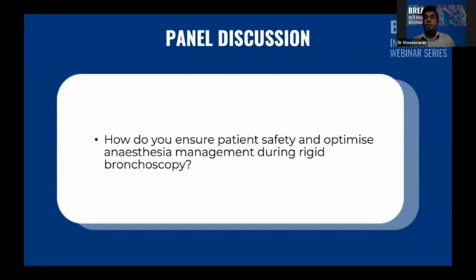Another thing is, especially when it comes to foreign bodies, and more so for a pediatric population, it is always advisable to have an ENT on backup, at least on call. When you are removing these foreign bodies, they may get stuck at the glottis and cause glottic edema and make your airway unstable. In such cases, going for an emergency tracheostomy can come to the rescue.